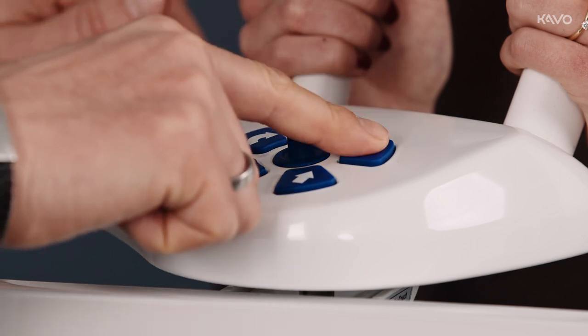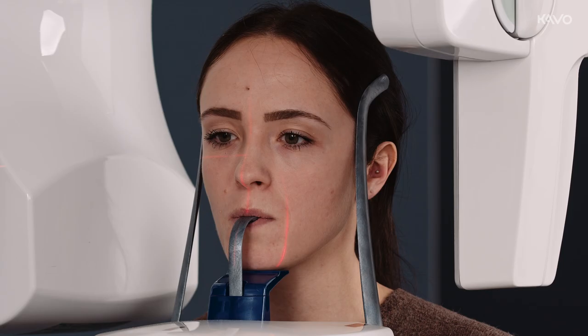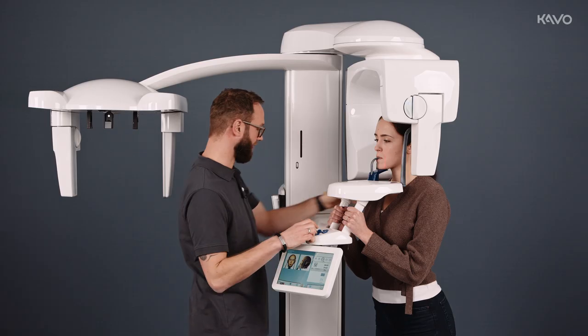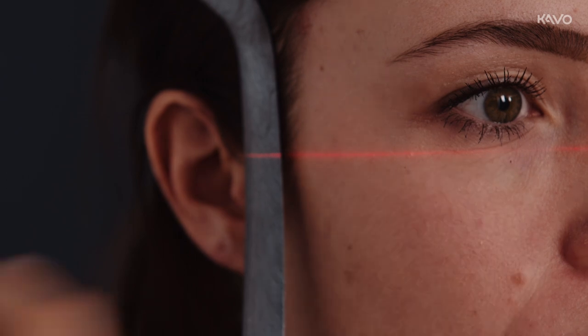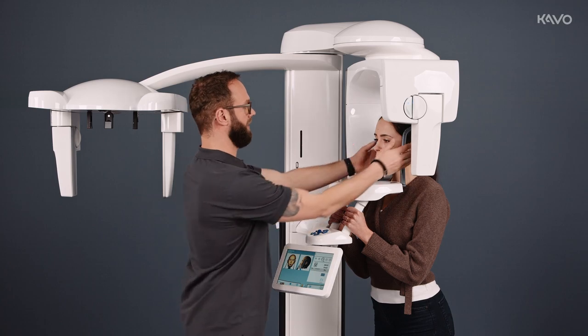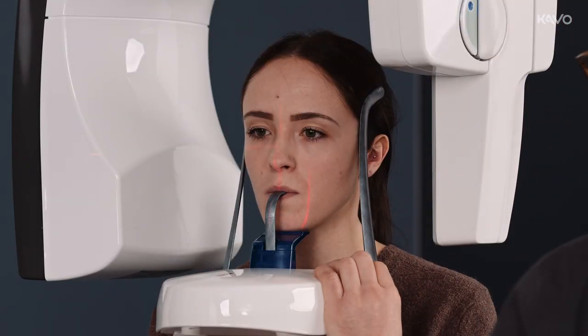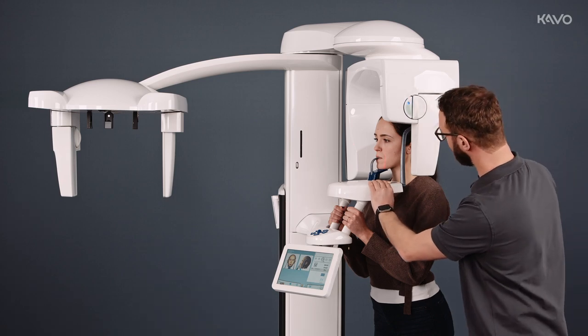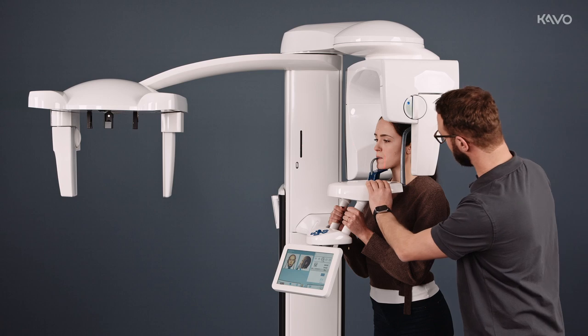These two arrow keys are not required for the ProXam 2D. We align the Frankfurt horizontal with a rotary knob here. Feel the lower floor of the orbital cavity. Align the mid-sagittal. And finally, the canine laser, which should be between 2 and 3 on the upper jaw on the unit.